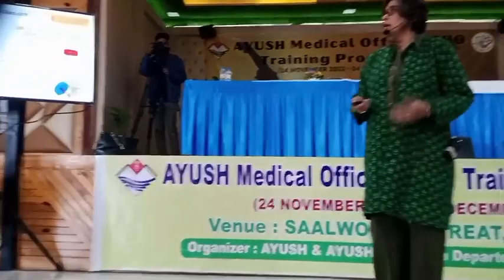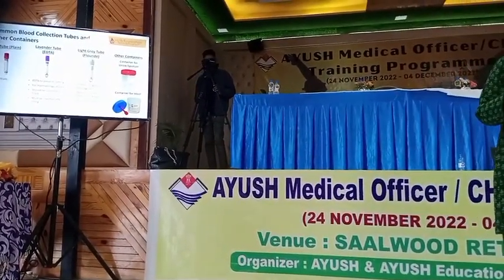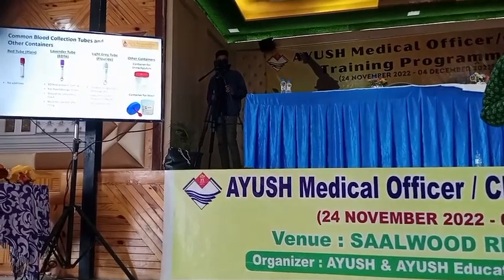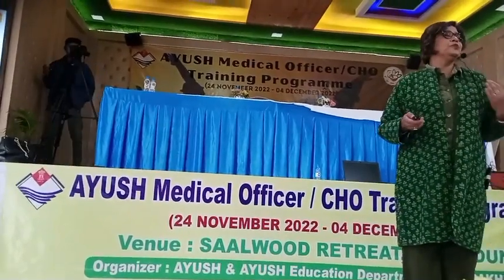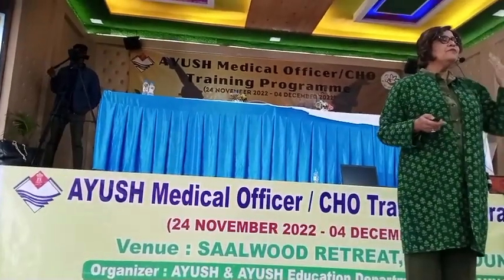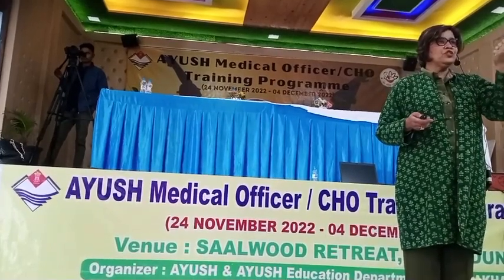Now, we have the common collection tubes. All of you are aware of the collection tubes? How many of you have ever collected samples? None of you? So there are different color tubes. And even the injection needles you have seen are different colors. There is a meaning to that color.